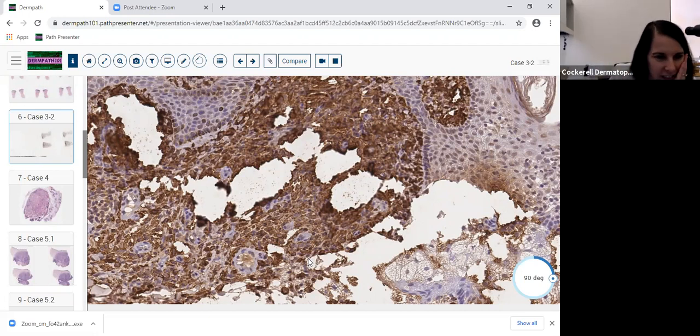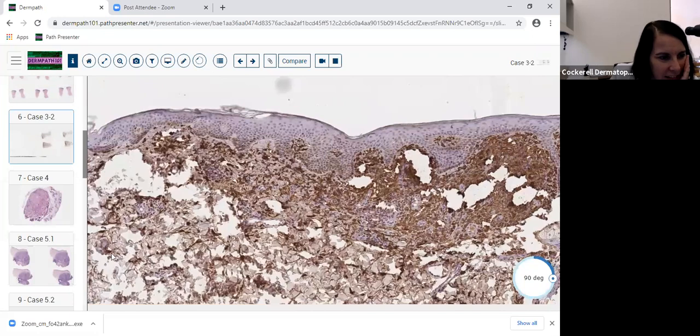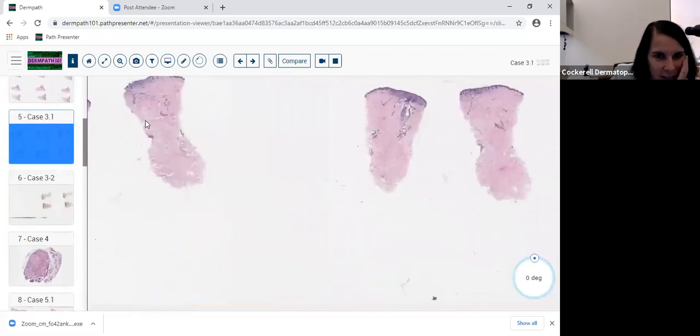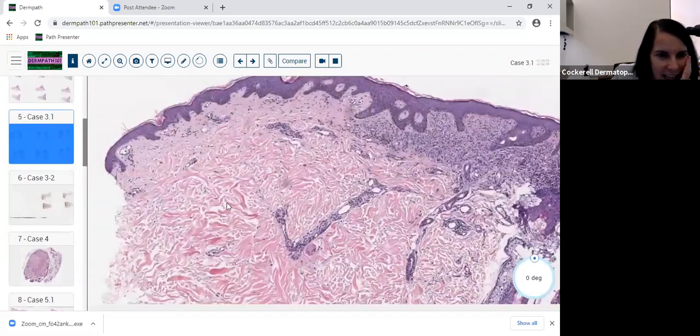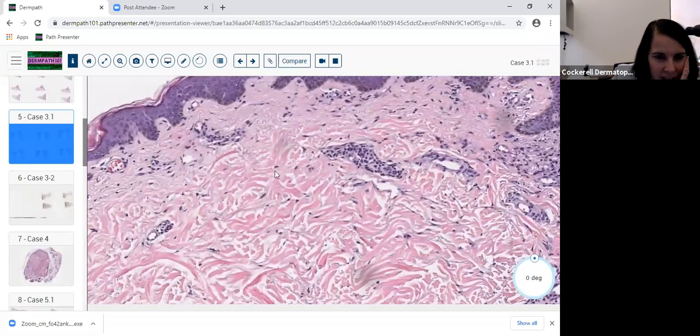And other stains are Leder stain, which can stain the mast cells, and CD117 and C-kit. Don't forget about CD117 and C-kit. And why is this different? Now, if I had only this area, let's go back to the other slide a second. If I only had this area here, I might say on a report, there's a superficial perivascular dermatitis with an increase in mast cells. And basically what I'm asking you all to do is clinically correlate.